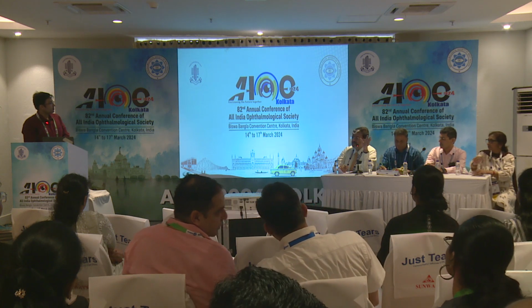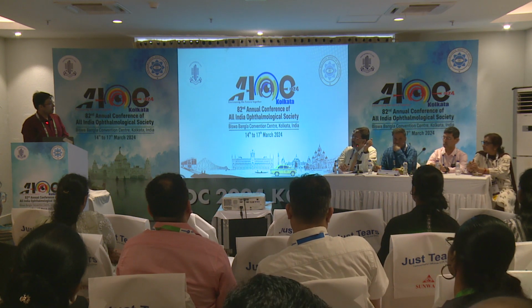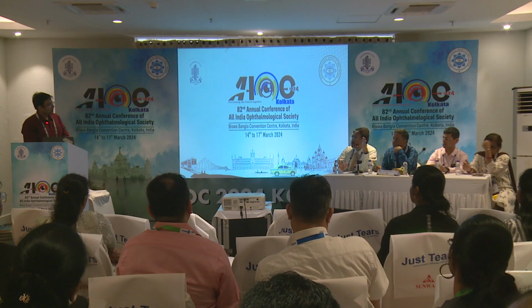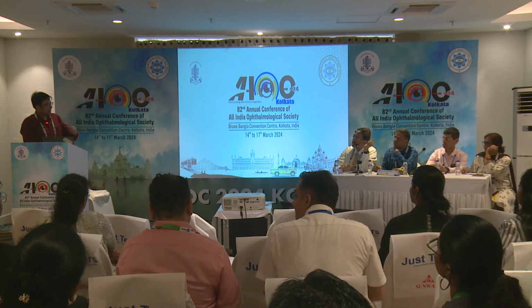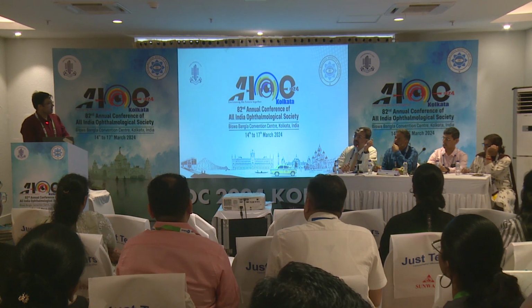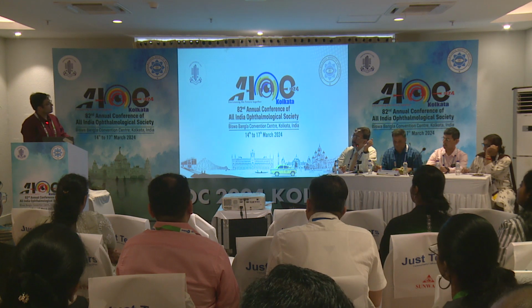In the study, you said it took more time for scanning. How did you judge that? Because when you're doing an indirect ophthalmoscopy, you're not really timing yourself. We did time ourselves. In finding a particular lesion, how did you have the start point and the end point? We started from the start of indirect ophthalmoscopy till the diagnosis of the fundus, either it is normal or with any pathology. So why did smartphone take a little more time? The practice, sir, because we are more accustomed to indirect ophthalmoscopy, so that's the factor. If we practice more with smartphones, then it will be shorter, sir, definitely.